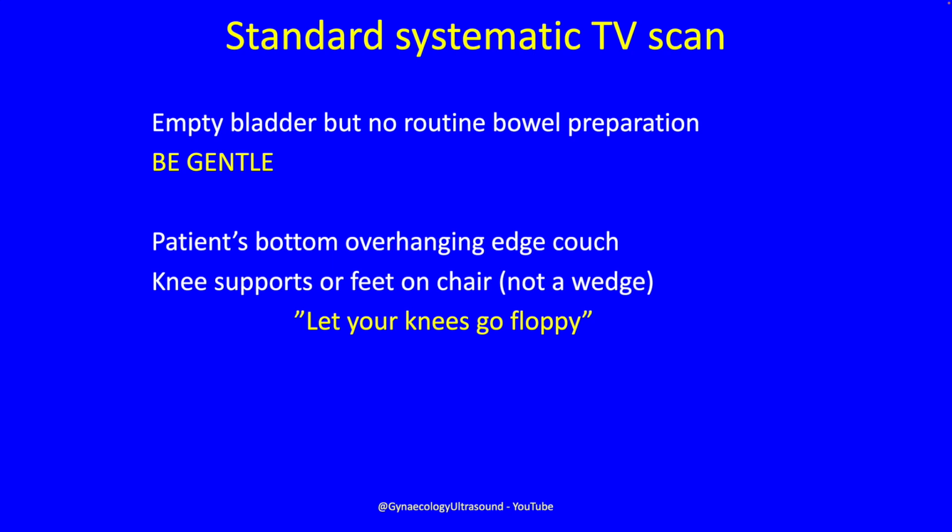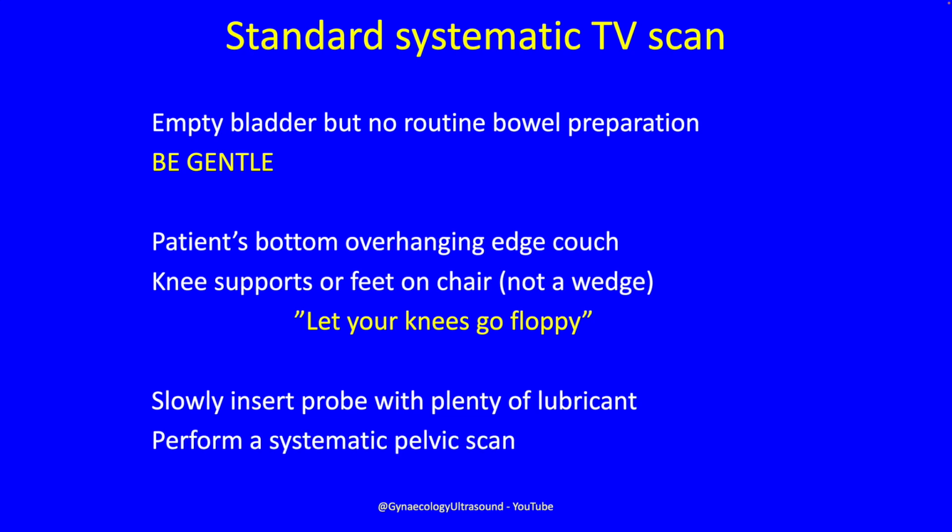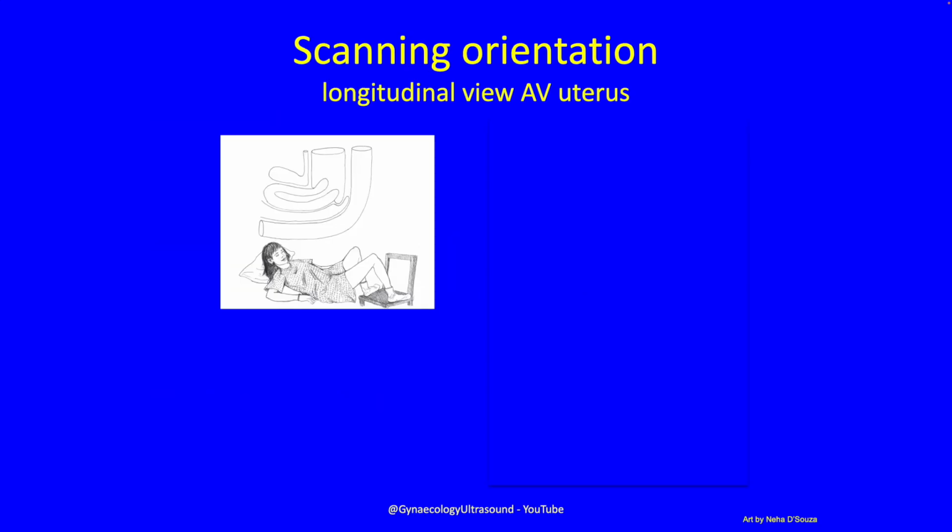What I say several times during the investigation is, let your knees go floppy. This makes all the difference in the world. Let your bottom sink into the bed and let your knees go floppy. And say, I will stop. If it's sore, I'll stop straight away. You tell me, and then patients will trust you and you'll get much better views. Very slowly and gently insert your probe with plenty of lubricant and perform your systematic pelvic scan.